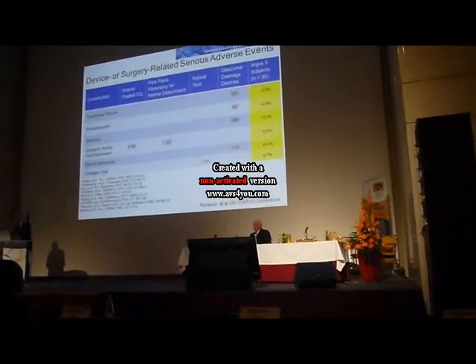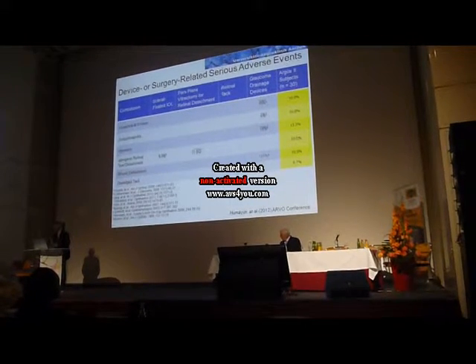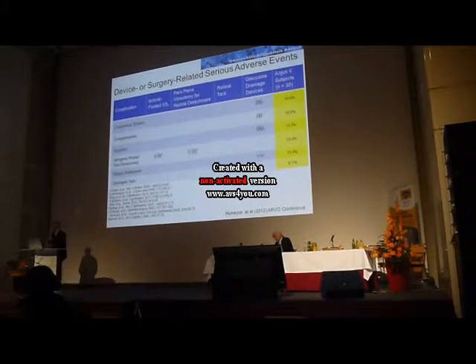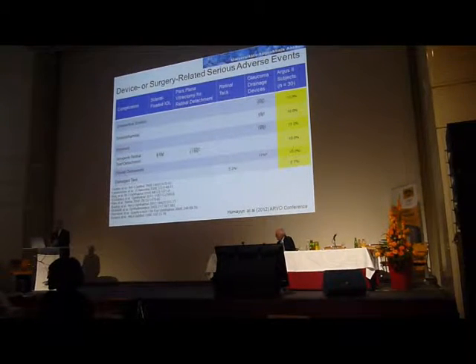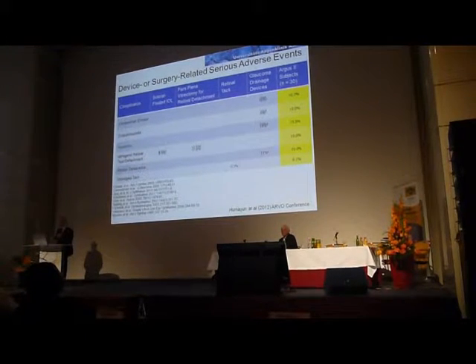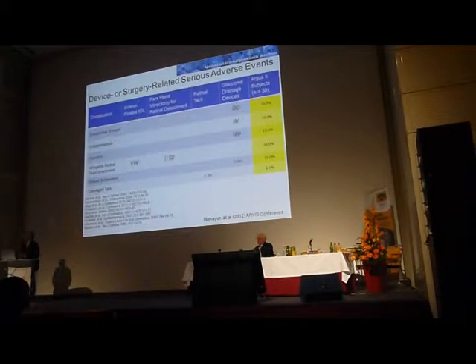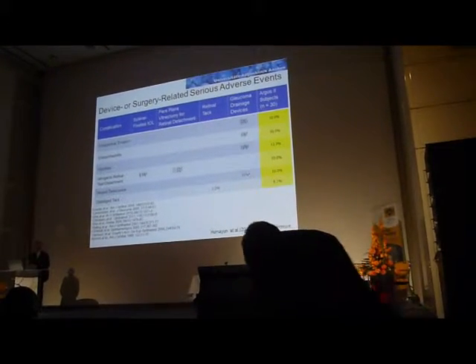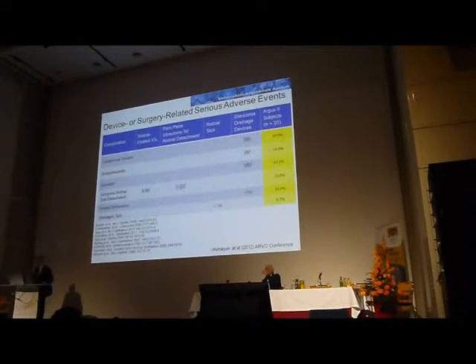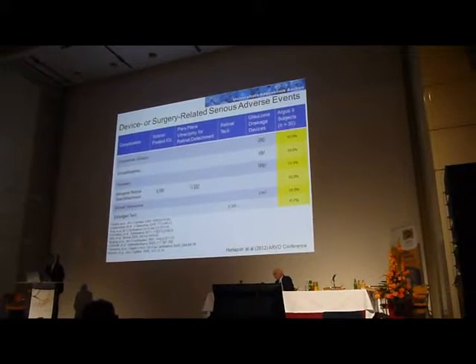These complications have to be seen in relation to the surgical process, and for a retinal surgeon, the amount of adverse events is well within the range of normal vitreoretinal procedures. If you think, for instance, of macular translocation, which was several years ago a treatment for wet macular degeneration, we had 70% of patients with retinal detachment after the procedure, 7 out of 10. So in this case, the complication is really in a, let's say, normal range.